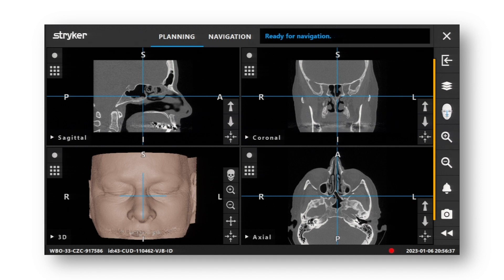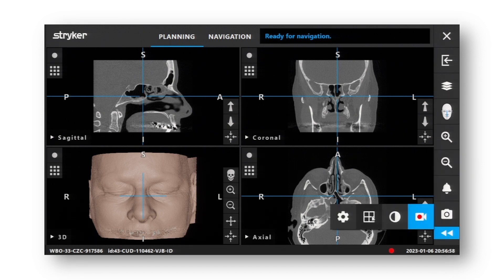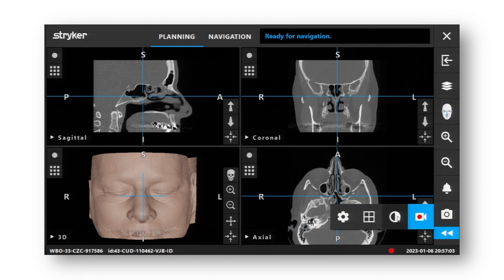The various icons on the side panel allow you to load another patient scan, choose a registration method, zoom in and out, choose image capture capabilities, configure your screen layout, and adjust your CT contrast.